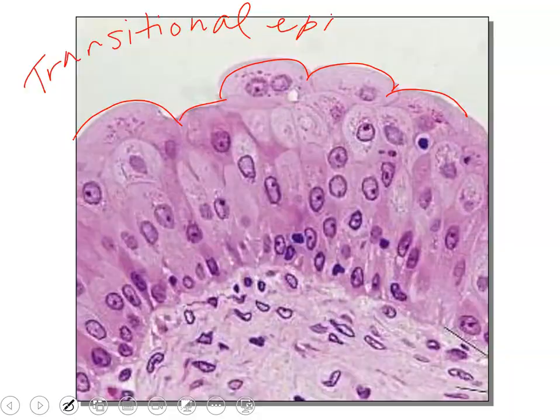All right, guys, so that is the epithelium that you will expect to see on the first practical exam. Again, please make sure you review these slides as well as the resources that I provided for you. Make sure you are working on your spelling. And then take a look at the other histology review video that is on my YouTube channel.